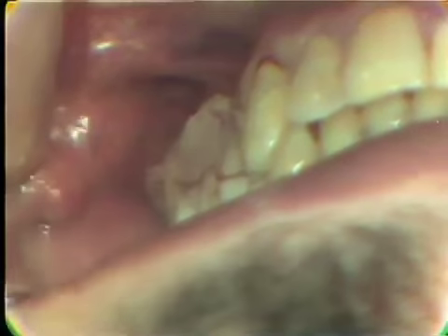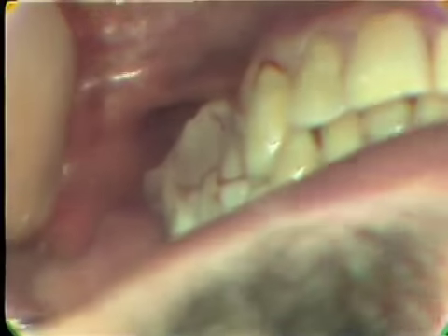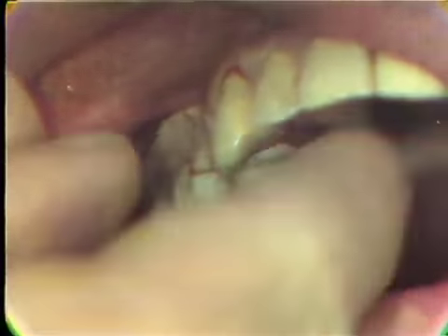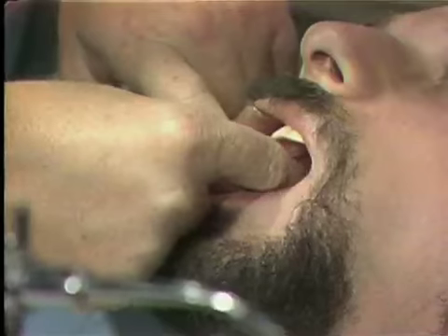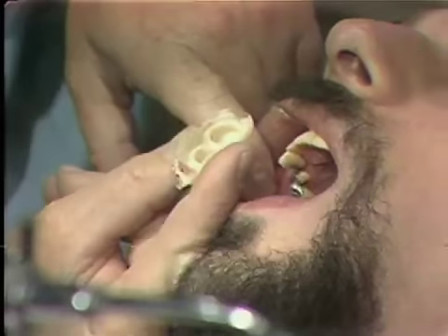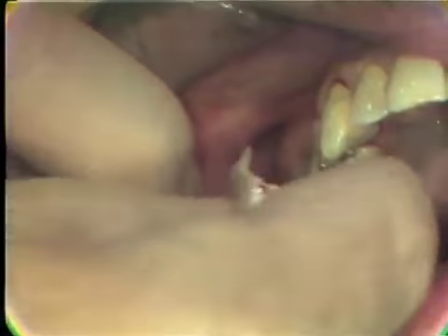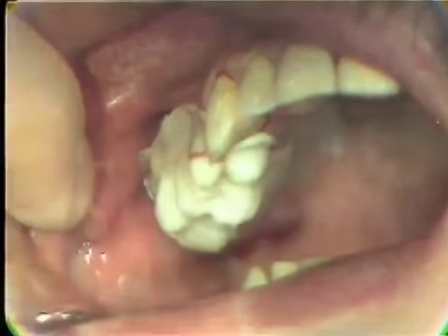doughy, we want to take the temporary on and off of the tooth. Open, please. So we want to gauge the set of the temporary so that we can take it on and off. Close, please. Open, please.